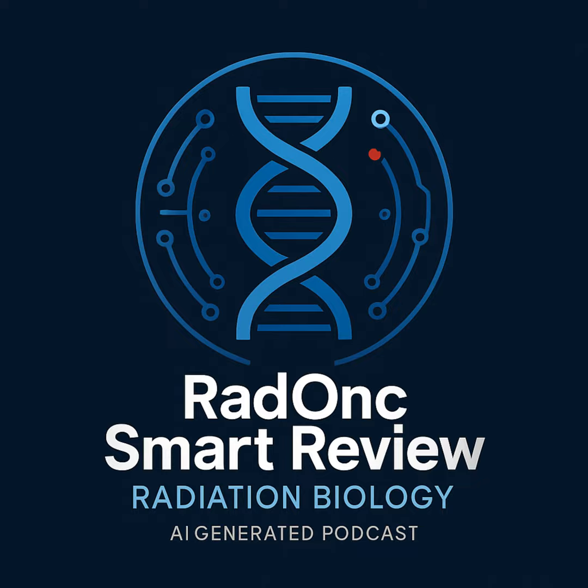Okay, good. Now, what about dynamic contrast enhanced CT? DCE CT. Is that something we need to know in detail? So DCE CT is more of a functional CT technique. You inject the contrast, but then you image really fast over time. You capture the contrast arriving in the arteries, then moving into the veins, and then maybe a delayed phase. So you're watching how the contrast moves through the tissue.